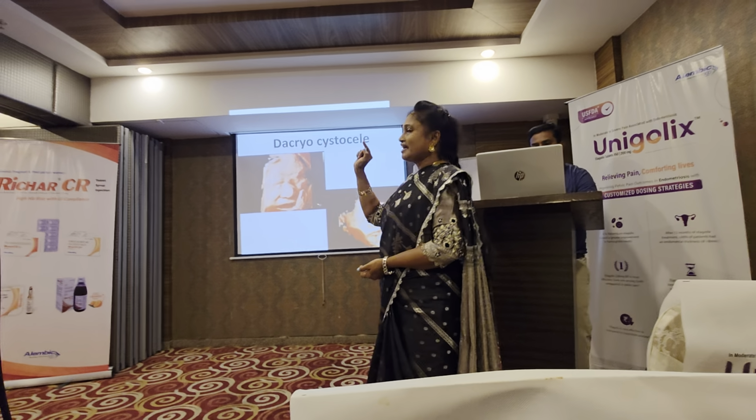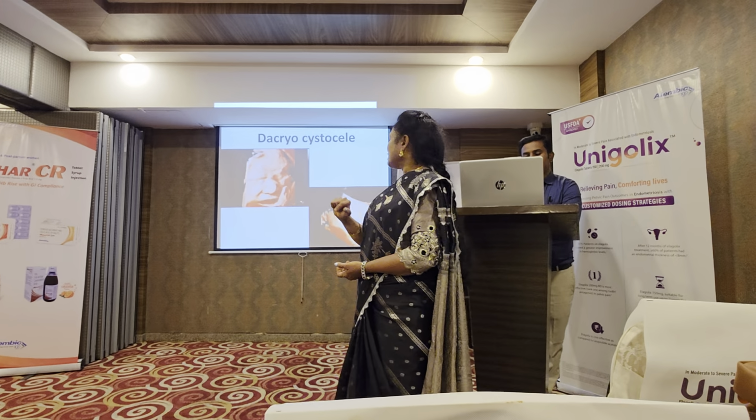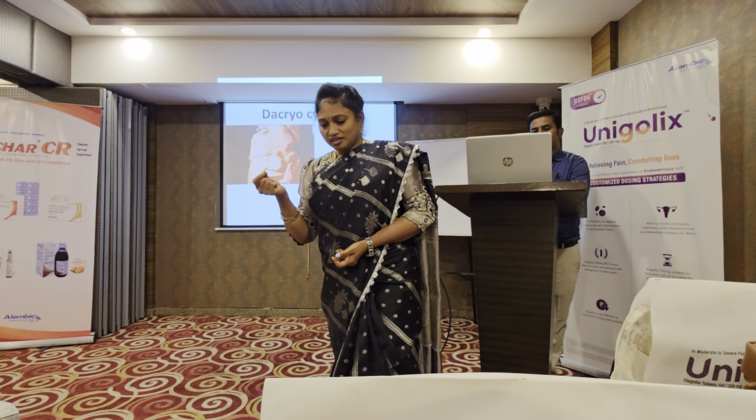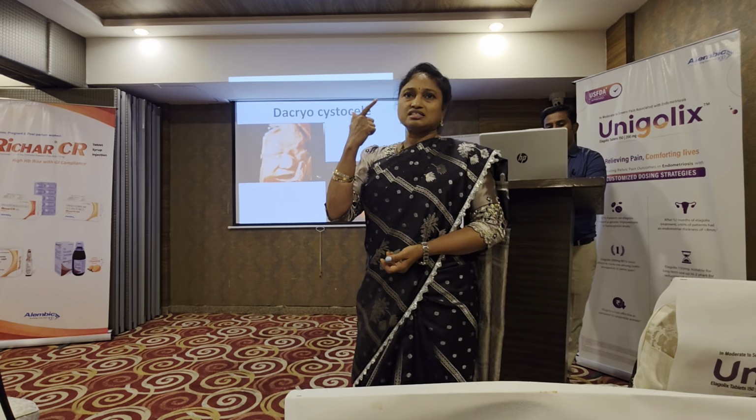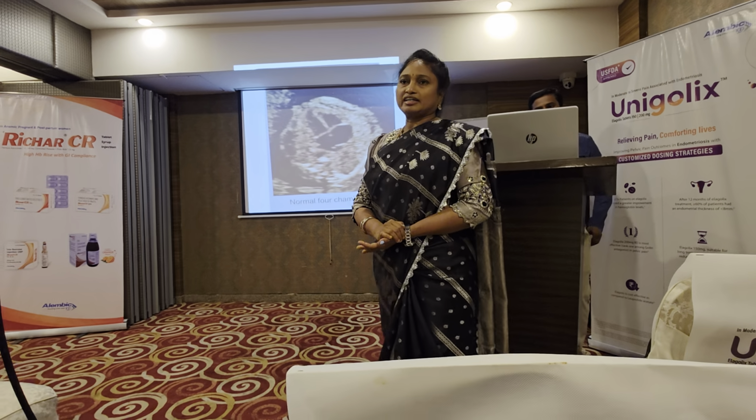Next one. So that is a small dacryocystocele, blockage of the lacrimal duct, which again can be cleared. After delivery, I think they just give a massage and see or clear the duct. That's all. Next one. Now for the heart.